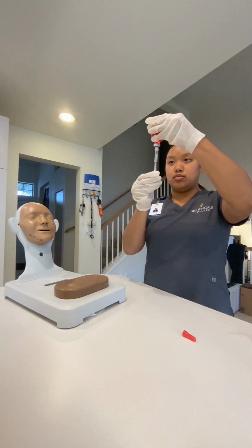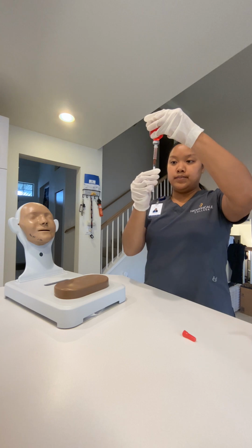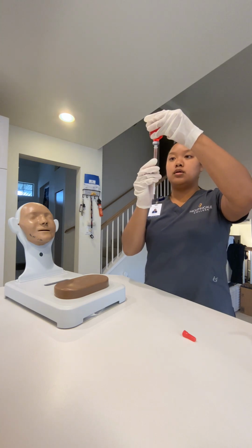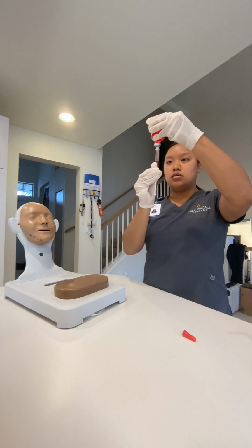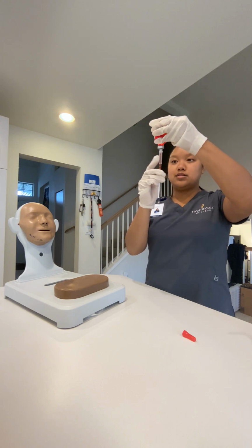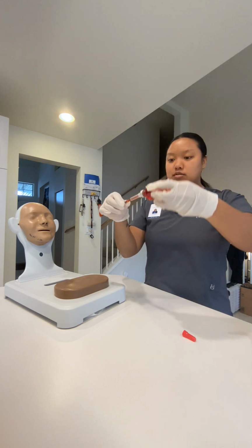So I'm gonna go ahead and pull again, just to ensure. Yep, there you go. Tap, tap, tap. No bubbles. I realized that you have to tap this kind of hard to get those bubbles out. There you go. So I already got it.